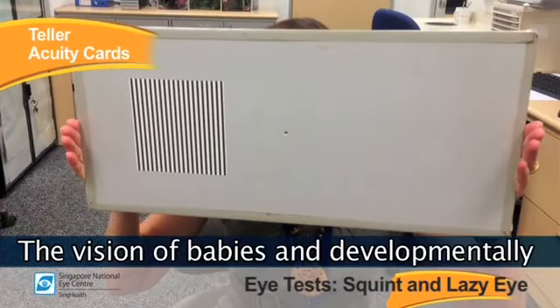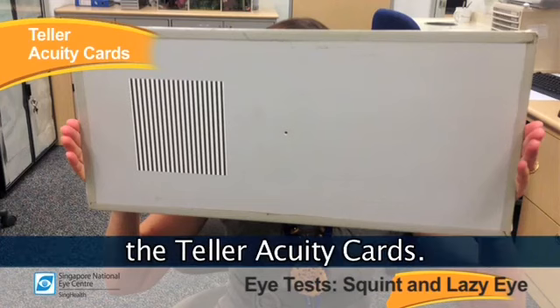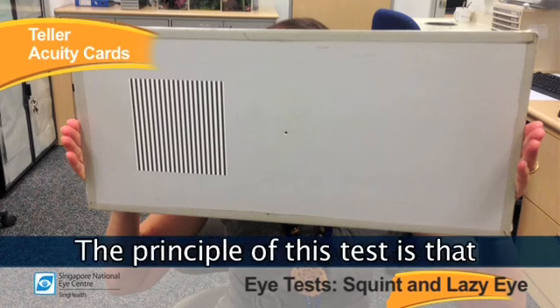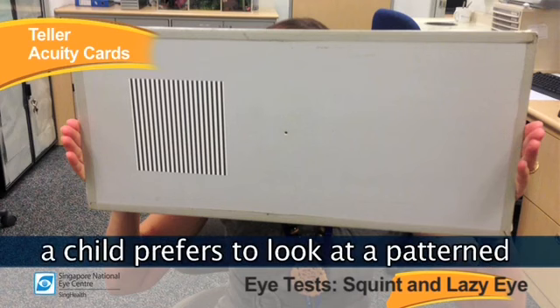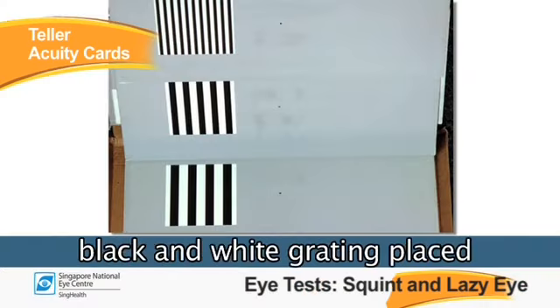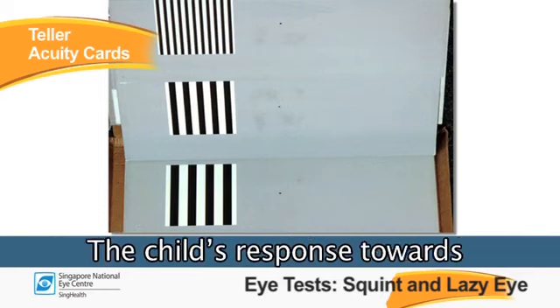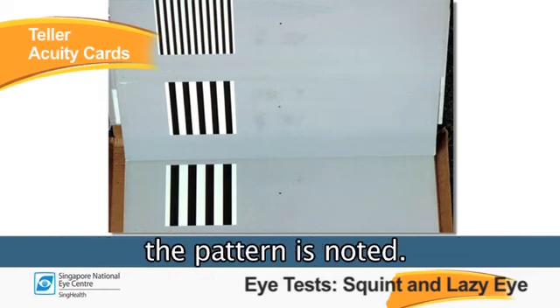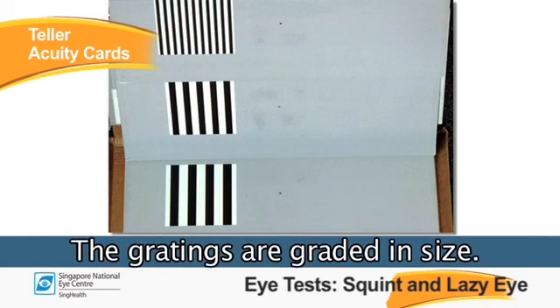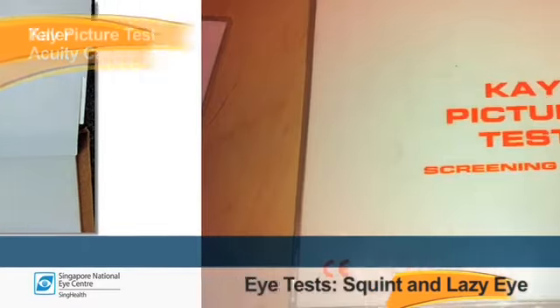Vision of babies and developmentally challenged patients is tested using the Teller Acuity cards. The principle of this test is that a child prefers to look at a pattern rather than a plain background. The test cards consist of a black and white grating placed on the left or right of the card. The child's response towards the pattern is noted. The gratings are graded in size. This test takes about 3 to 5 minutes to perform.